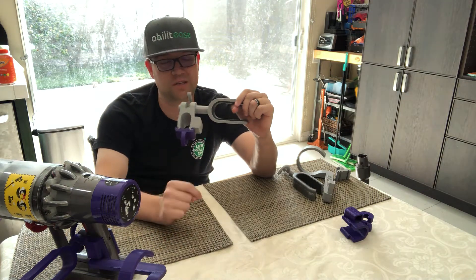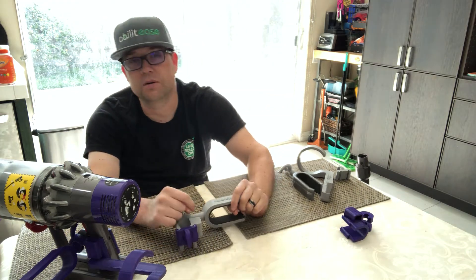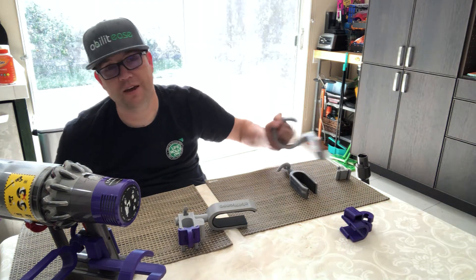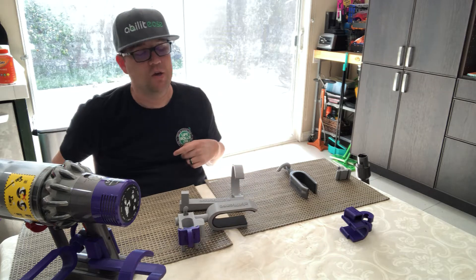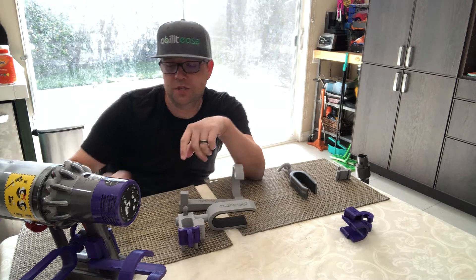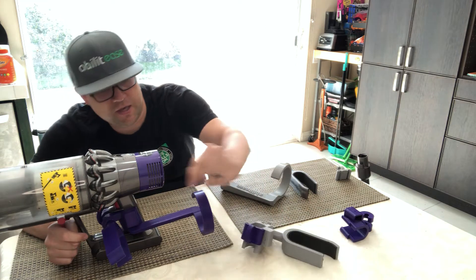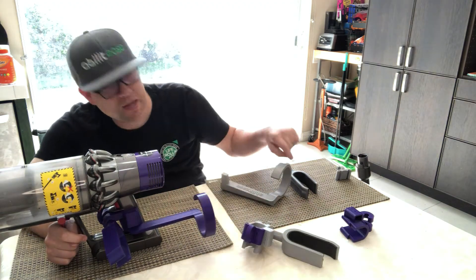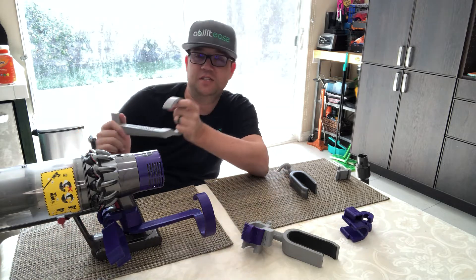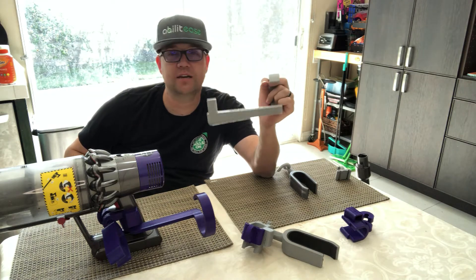When it's on the actual unit it expands a little bit, due to my imperfect engineering, but it works pretty well. It creates a nice enclosure that's snug so the whole thing won't slip around, allowing you to attach the larger attachment. The other big concern was the flex and strength of the cuff for my forearm — this version 1 cuff is kind of flimsy and would not support the weight of the larger attachment.